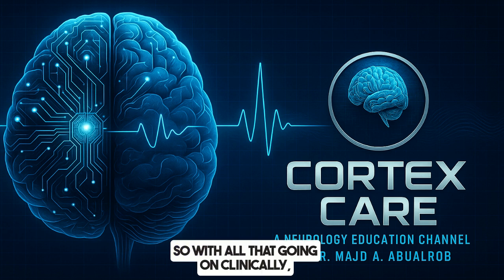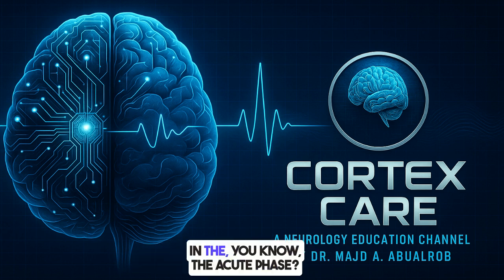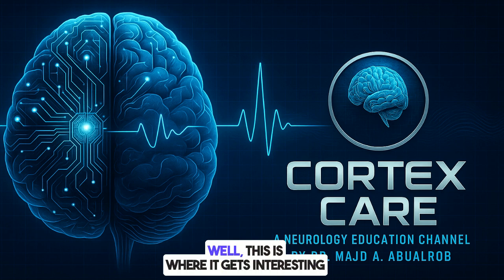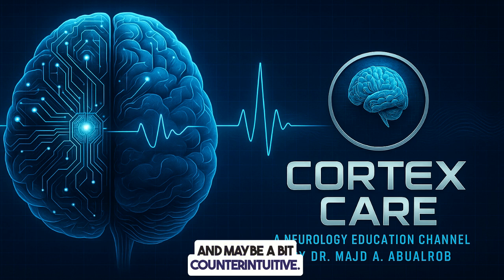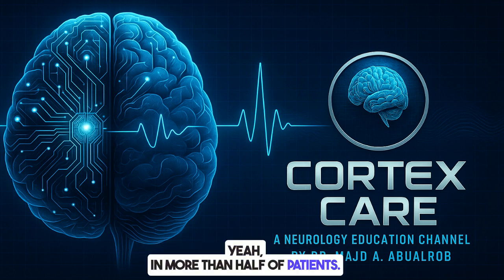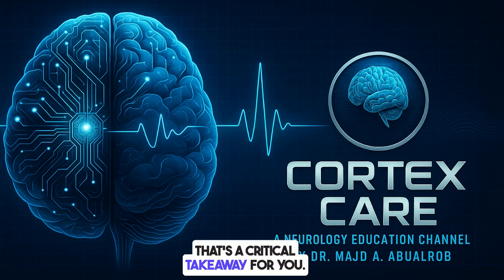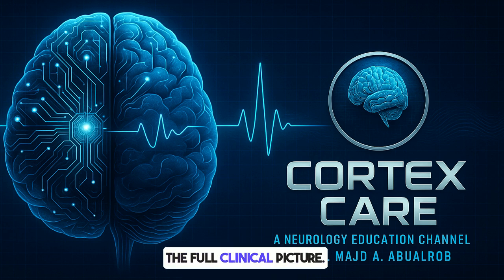With all that going on clinically, what does the MRI typically show in the acute phase? This is where it gets interesting and maybe a bit counterintuitive. In the acute stage of NMDA receptor encephalitis, the MRI is often normal, even with psychosis or seizures. In more than half of patients, actually. It's a really key point. A clean scan doesn't rule it out. Absolutely not. That's a critical takeaway. Clinicians really need the full clinical picture.